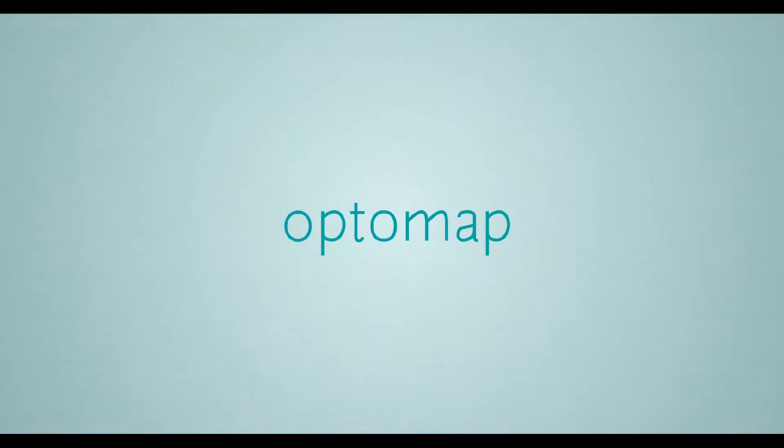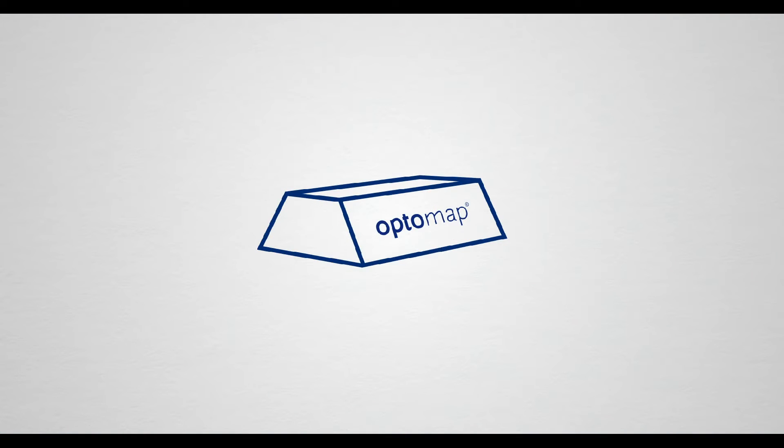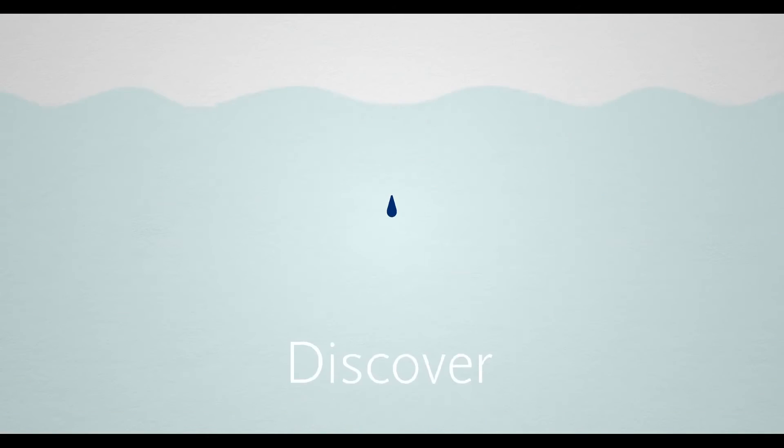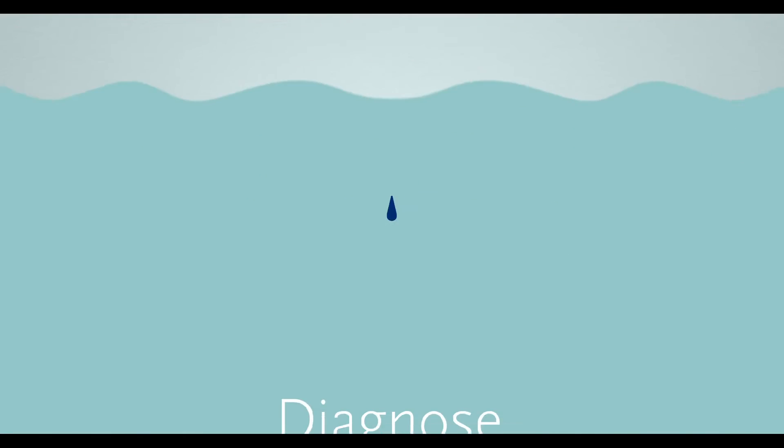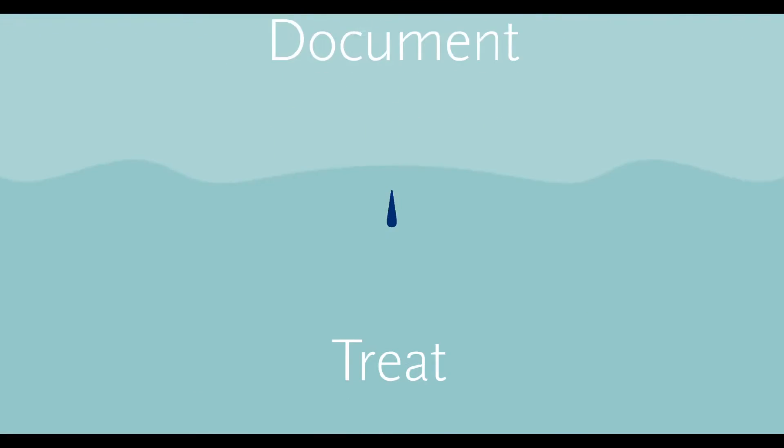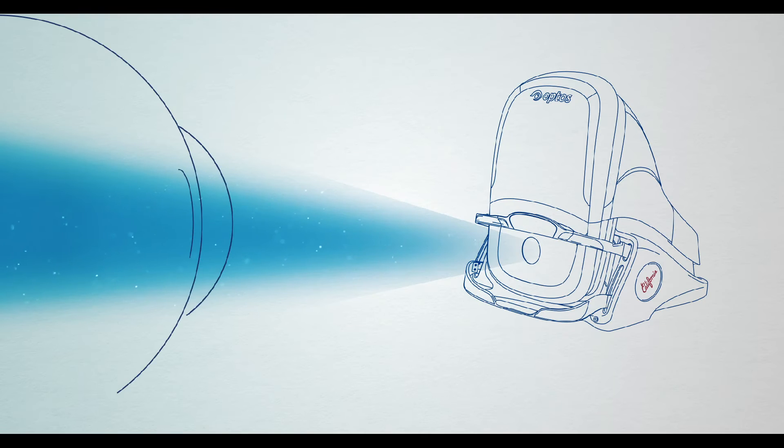Our passion has made optomap the gold standard in eye care. Optos's latest ultra-wide field retinal imaging technology allows you to discover, diagnose, document and treat ocular pathology, which is undetectable using traditional technologies.